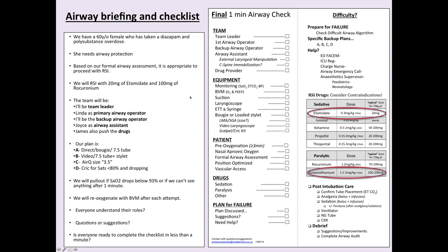And then right before the drugs get pushed, after everyone thinks they're ready to go, just run through this checklist in a call and response manner as fast as possible. And I think you'll be good to go.